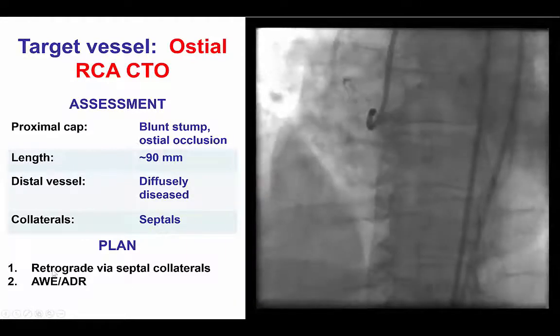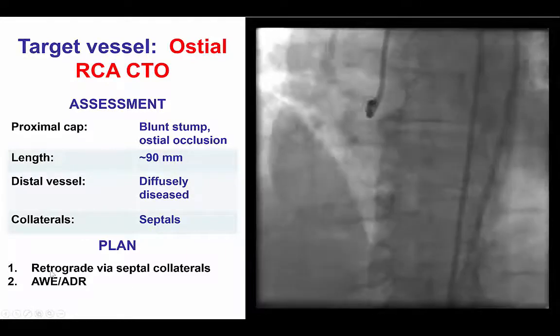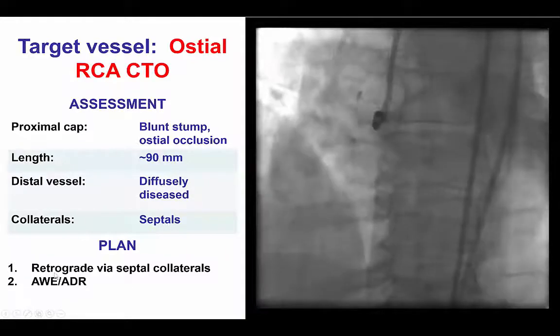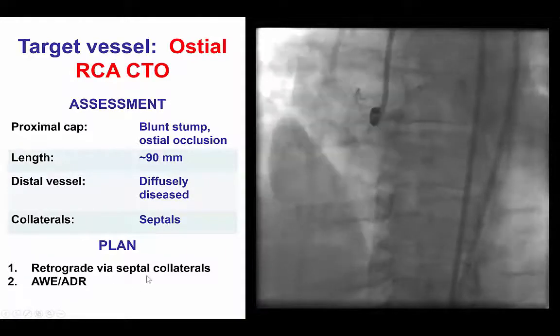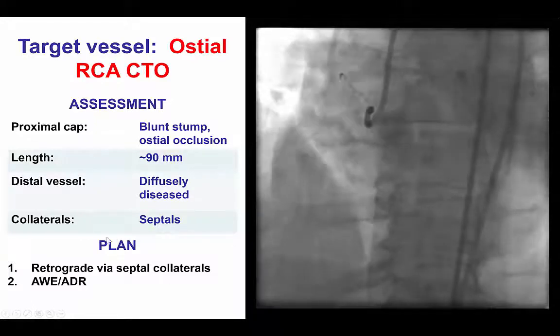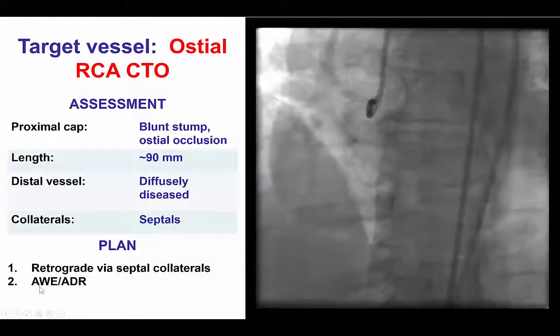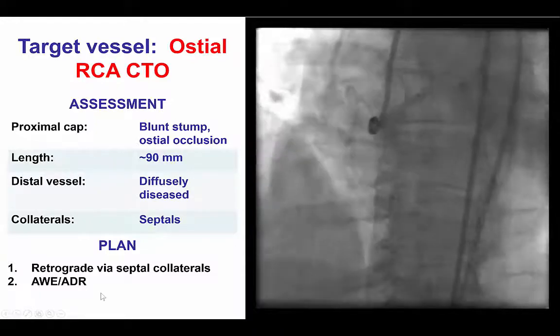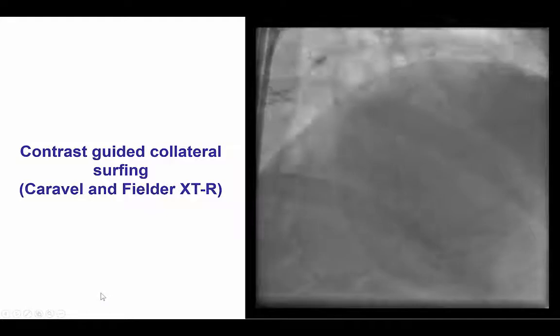The plan was to try first retrograde through septal collaterals, given the ostial occlusion, followed by antegrade wire escalation or antegrade dissection reentry.